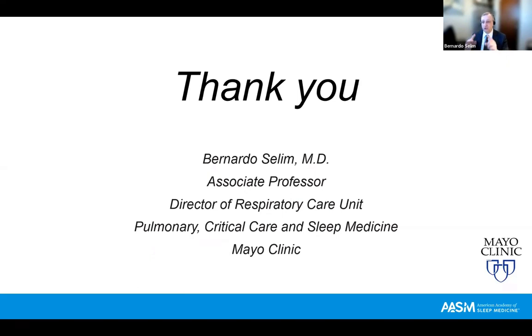And as far as you reach your goal, remember, this is not a matter of number. This is a matter of results. If your delta pressure, with a patient that can tolerate whatever leak comes from it, can still get you the total minute ventilation that you need, so be it. But to answer the question correctly, we have to refer to the type of mask, and every mask is different. This is why it's a little bit of a pain in the neck to go to each of the masks and try to find out. Definitely do not expect 25 or 20, that is your outpatient threshold for most of the masks, to be your threshold. You're talking about high pressure, high leaks.